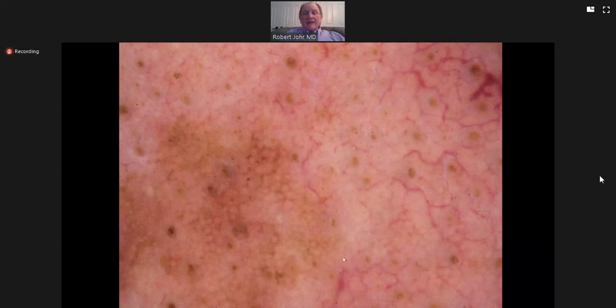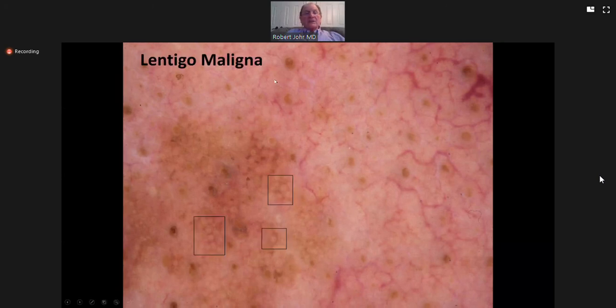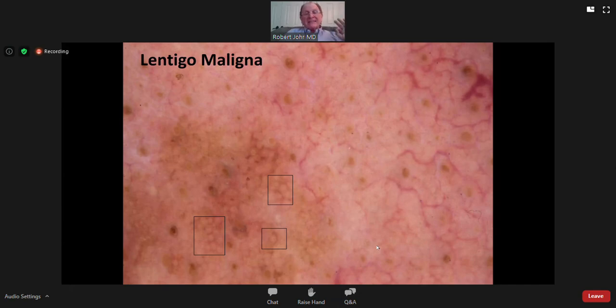Okay, so it's malignant. Asymmetrical follicular pigmentation. You don't always clearly see the follicular openings, but look, here's a follicular opening and there's asymmetrical pigmentation. So it's one criteria which is hard to see, like Dr. Lala said last week, but you can diagnose melanoma really early by finding even the slightest suggestion.